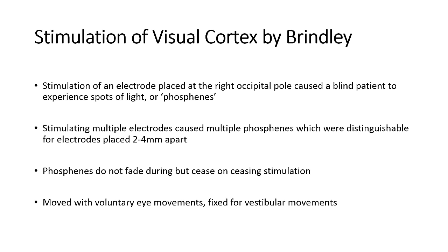Since they wanted to create a vision process with minimal invasive surgery, they used coils which pulsed radio wave signals through the scalp, and these coils were tuned to an appropriate frequency and placed above the electrode they were interacting with. They found that similarly multiple electrodes created multiple phosphenes as long as electrodes were placed 2 to 4 millimeters apart.